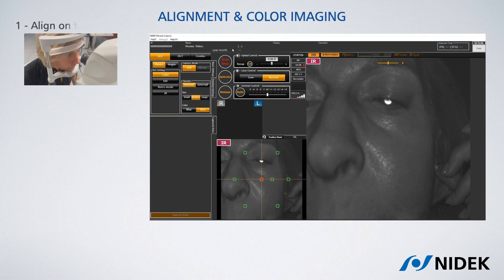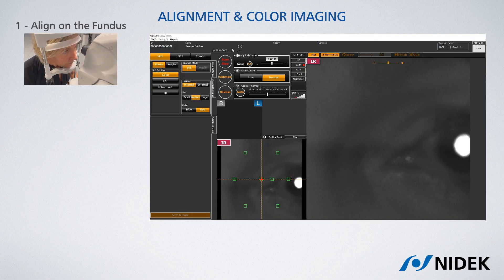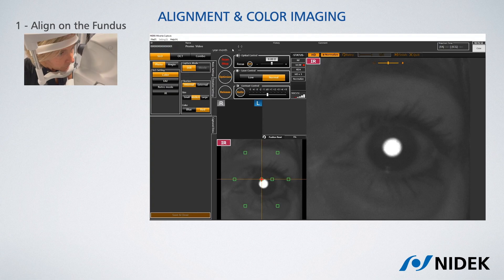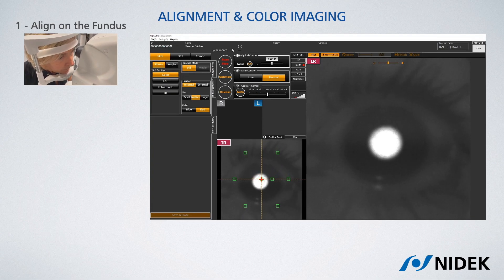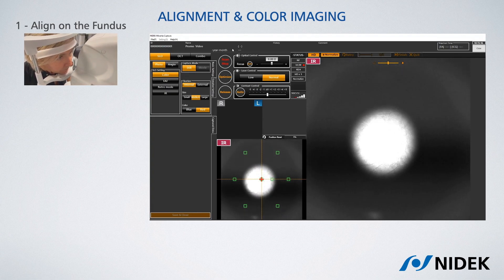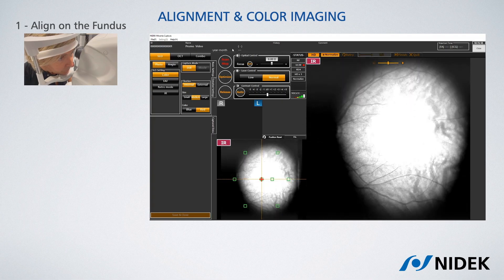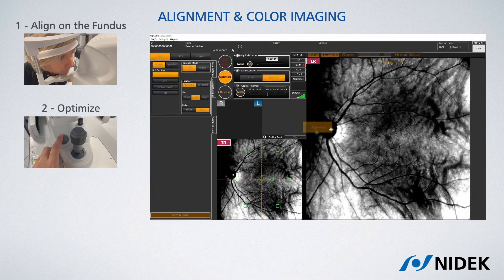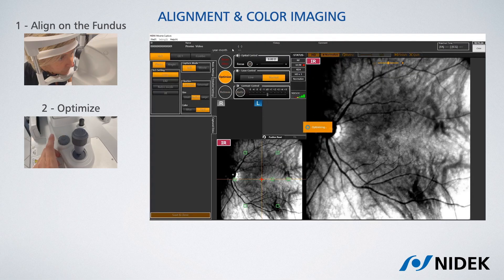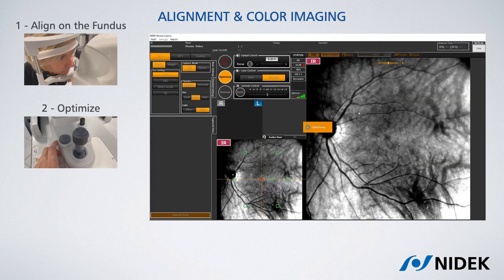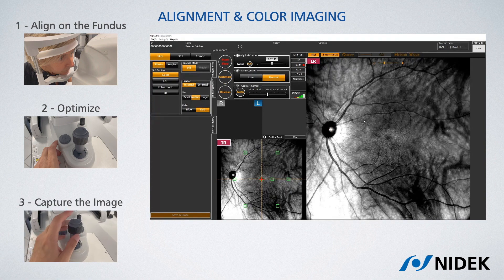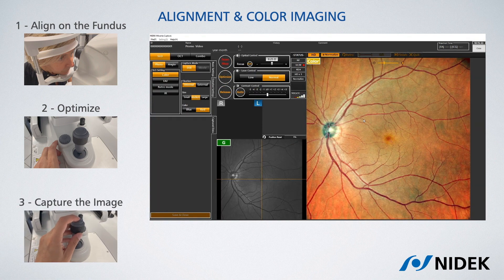Let's now see how to capture these images and let's start with color. You first have to align with the patient's eye, place the optical head in front of it and move towards the patient until the fundus of the eye is completely displayed. At this point you can trigger the optimize function which compensates for possible refractive errors, and once this is done, you can grab your picture by pressing the central joystick button.